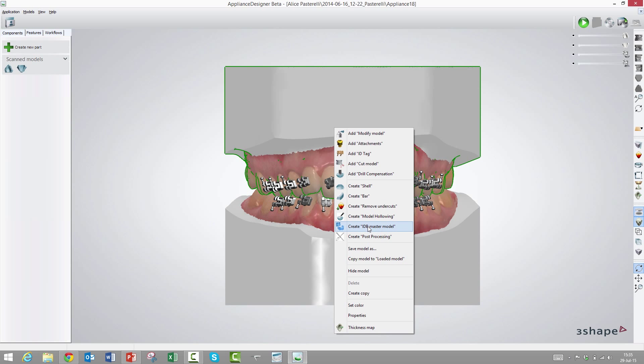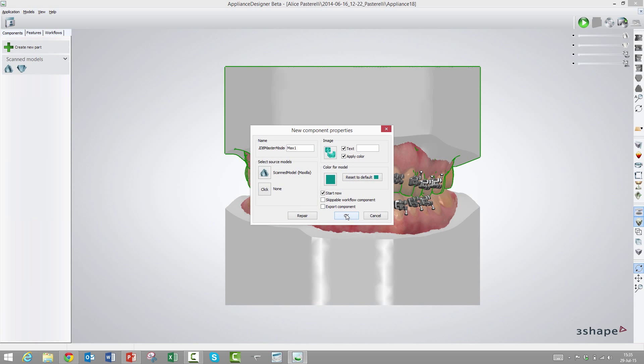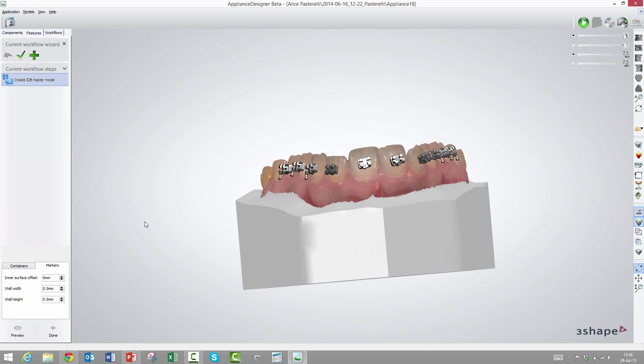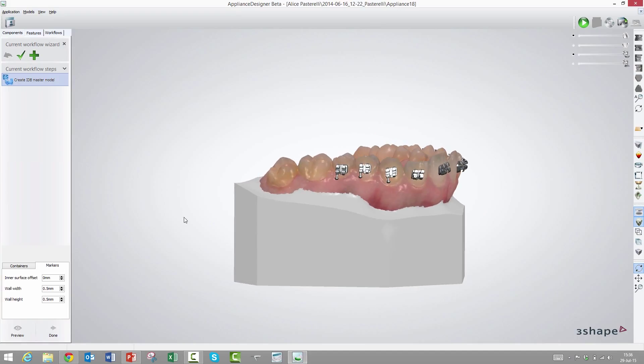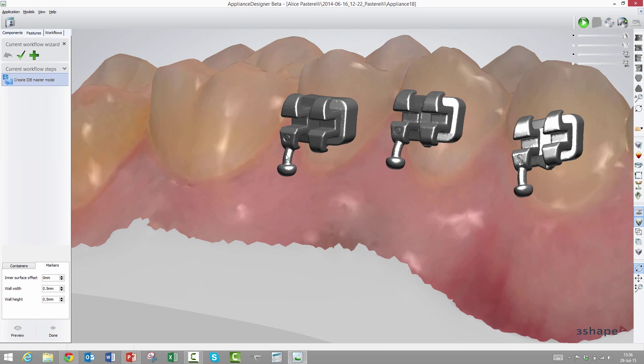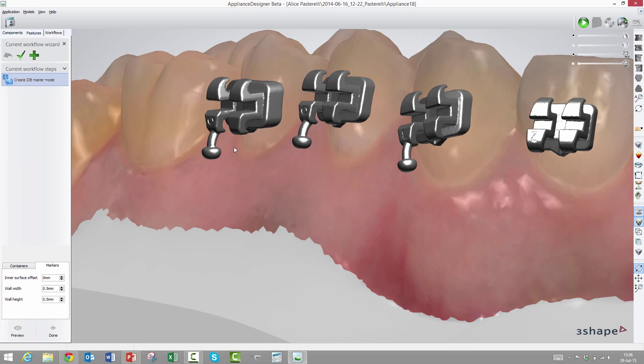We'll start with the most simple one called markers. The idea is that we will print the model without the brackets. Instead, there will be these tiny walls where the real bracket should be placed before we do the vacuum pressing. We will still need to protect the hooks and wings with silicone like you usually do in the real life workflow.